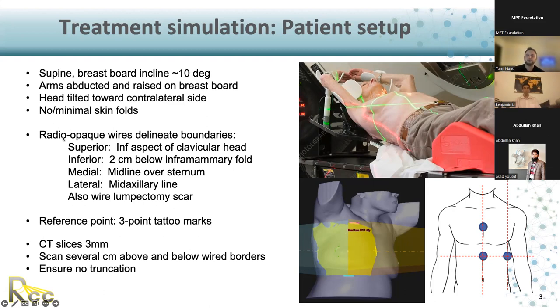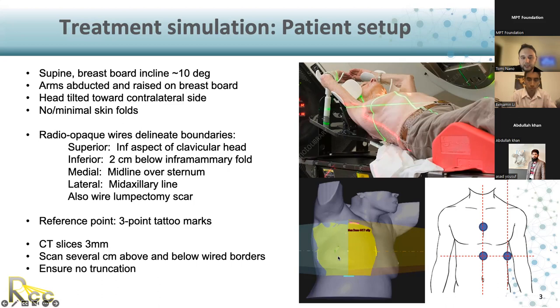Ben went through placement of the wires, and that's what's shown here in this 3D rendering of the patient surface. You can see the superior wire, the inferior wire, medial, lateral, and even a wire where the lumpectomy scar is, and also the field of view of these breast tangents. A dosimetrist or physicist at treatment planning tries to match the field to these wires, which is why they're very important and what we use to guide planning.